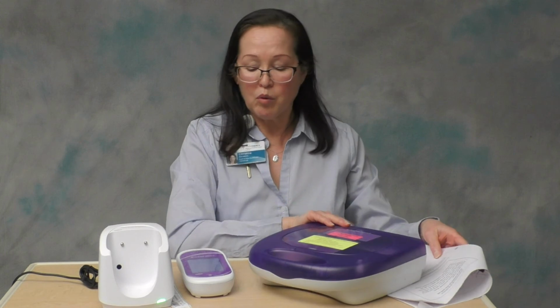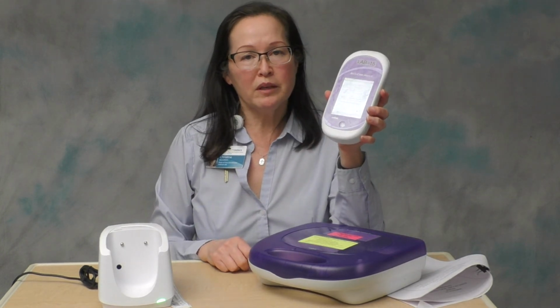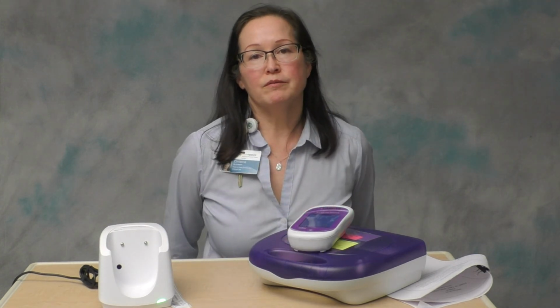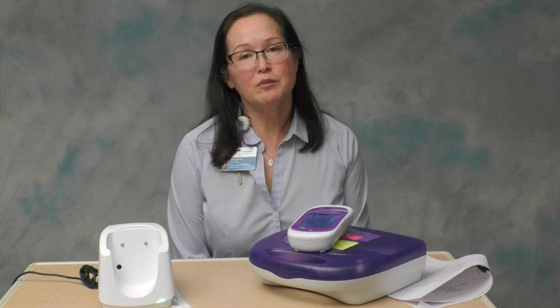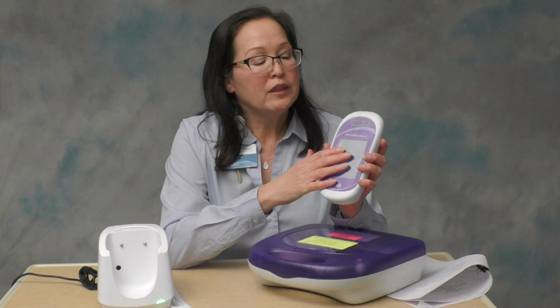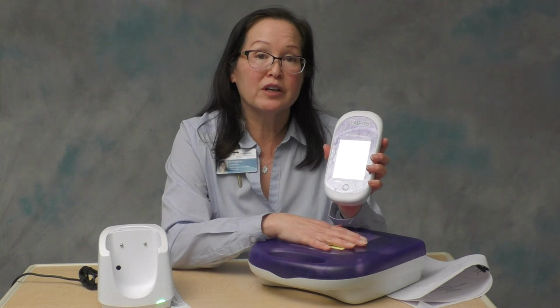And then we require that once the patient test is done, that you document that result manually in Epic under your flow sheet, vital signs flow sheet, using preliminary point of care glucose. The reason we require manual documentation of the result is because point of care testing allows you to test and treat at the bedside. You do not want to treat your patient unless you have documented need for treatment in Epic. When the result goes into this meter, it actually has to cross through 4 different softwares before it gets into Epic.